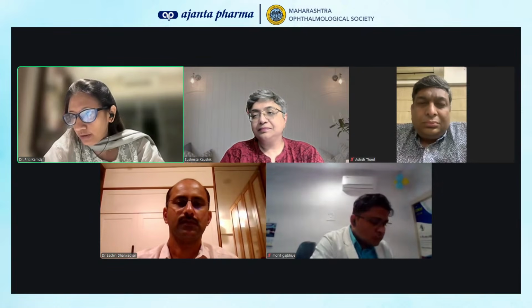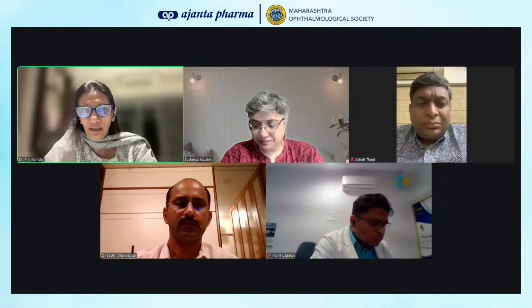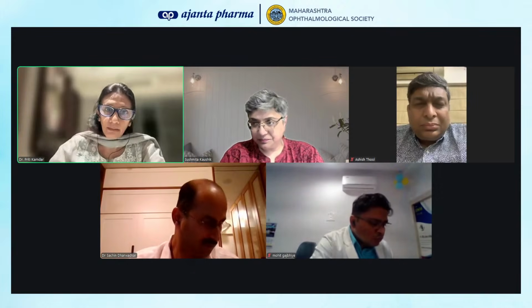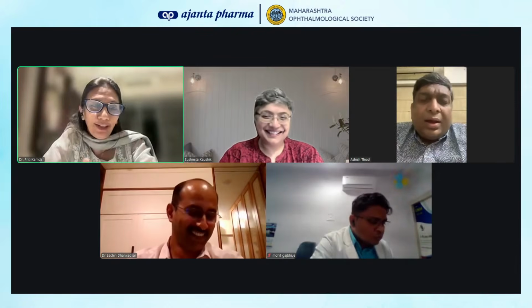Okay. OCT, RNFL in high myopes, which you have explained very properly. But just one line again from Dr. Ashish and Dr. Sushmita, how do you use OCT in myopes? He's already given a very nice explanation, but that question has been asked 5 times at least in the question answer. So that's why I'm saying, let's give some weightage to that question.